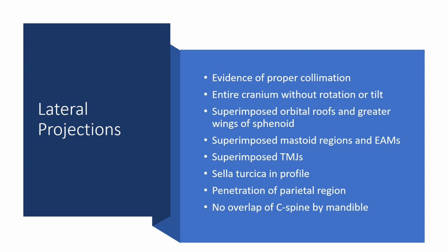Okay, fantastic. On page 34 of volume 2, the infraorbital meatal line is perpendicular to the front edge of the IR. So if you're laying them down on the table, the infraorbital meatal line has to be a vertical line that is perpendicular to the edge of the light field in the targeting light.